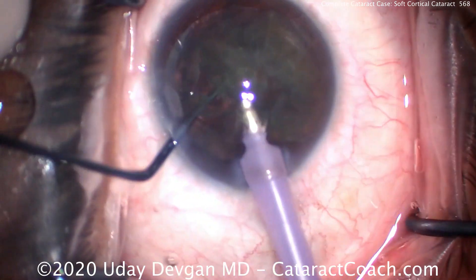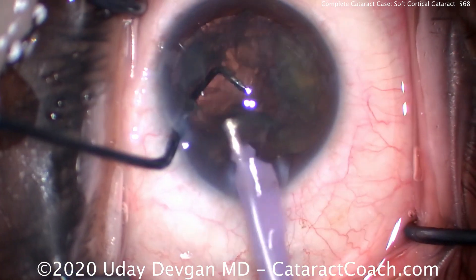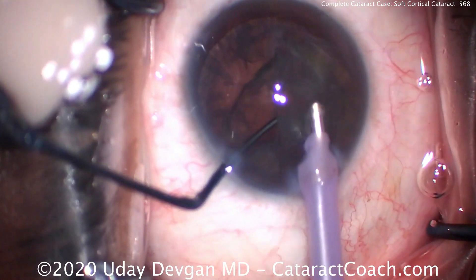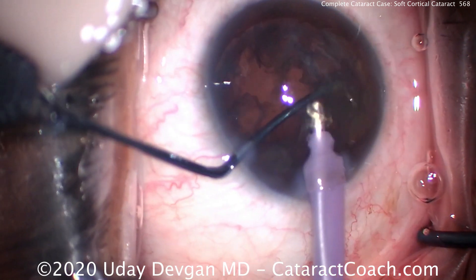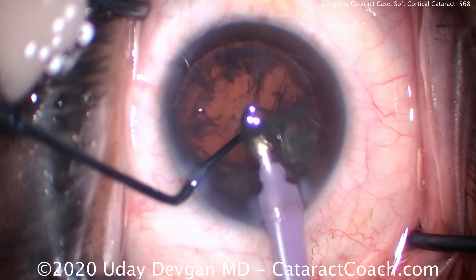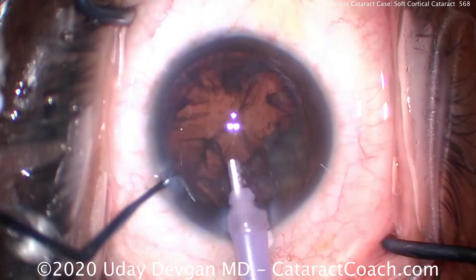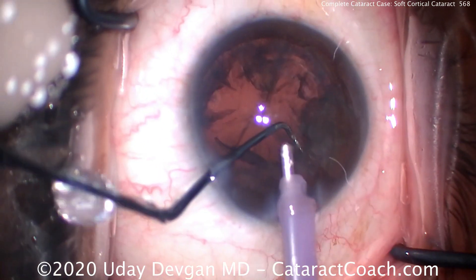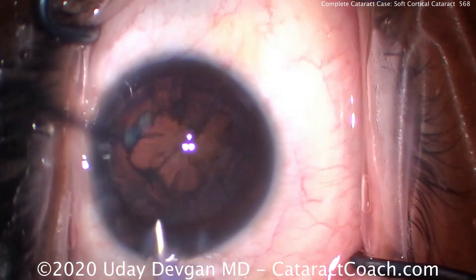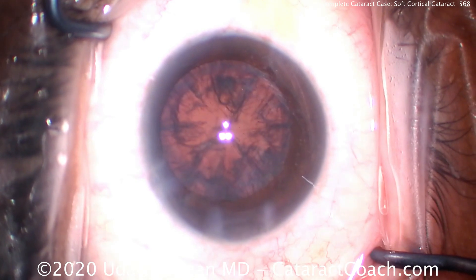Notice the position of my chopper in the safe position, with the blunt smooth end towards the posterior capsule, just to make sure we don't get any surge that would cause the posterior capsule to come towards the phaco tip. We can clean out most of that cataract, and any small remaining fragments can even be removed with the IA probe because this is a soft lens.